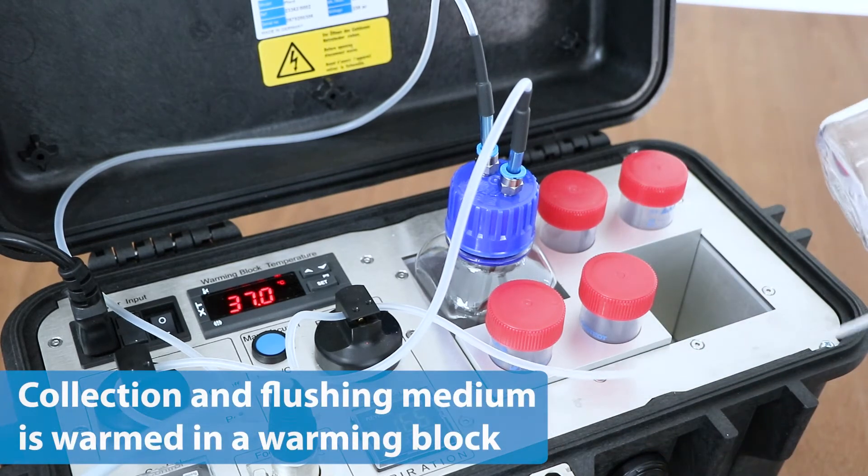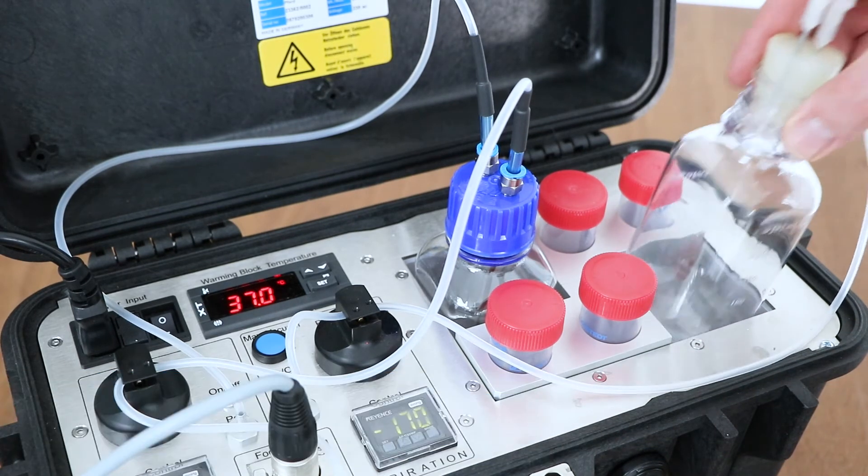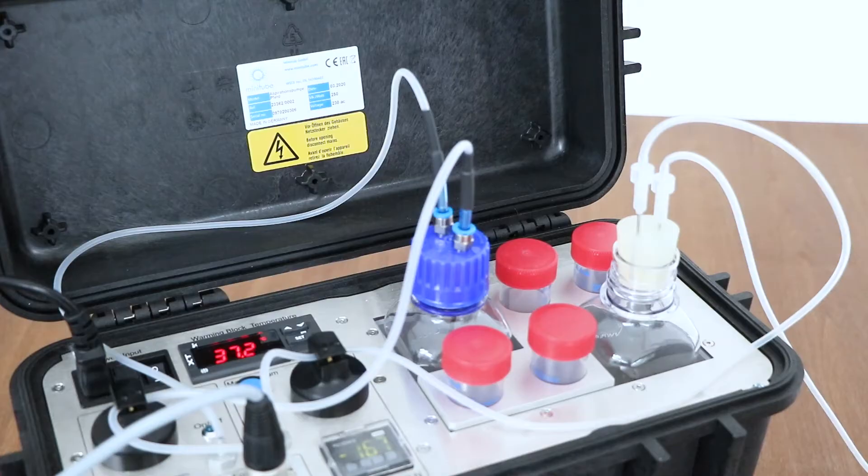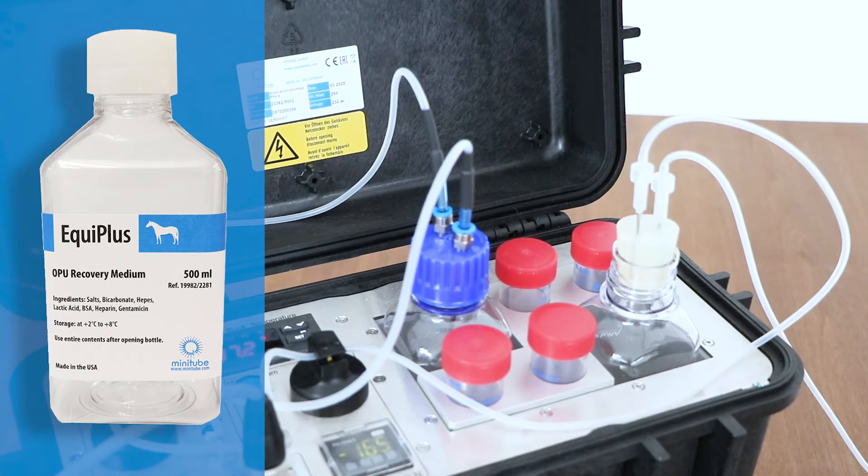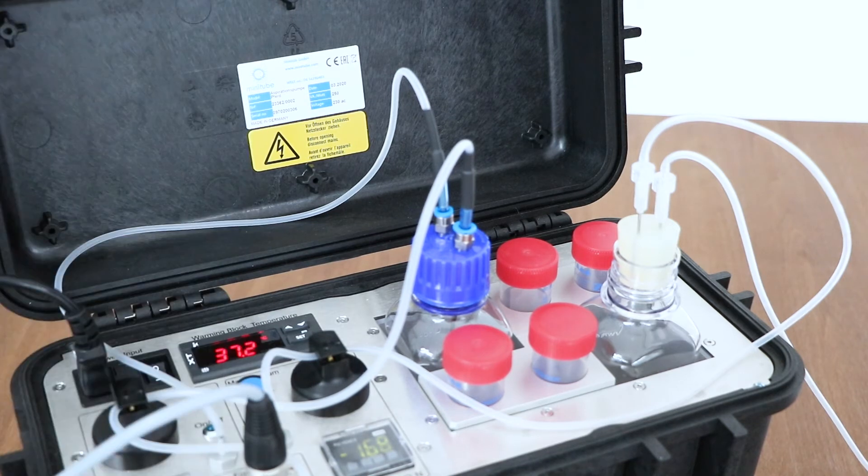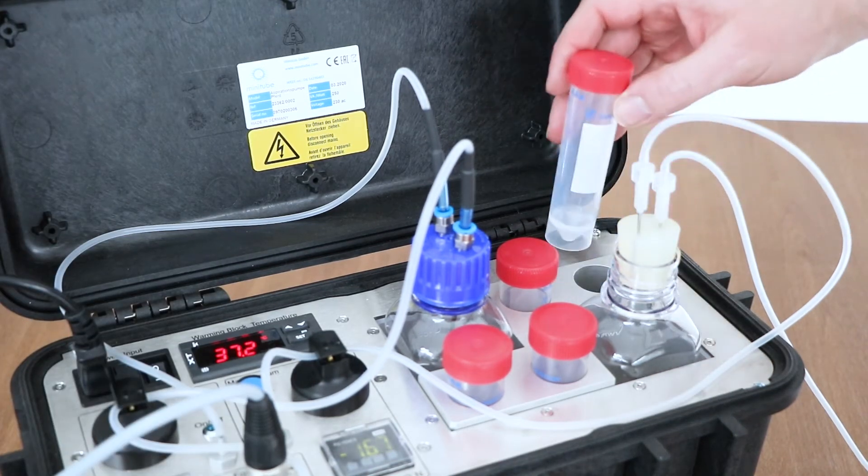The injection and aspiration bottles are enclosed by warm aluminum blocks to provide the correct temperature for the oocytes at all times. The collection and flushing medium is warmed in a warming block containing two 250 milliliter bottles and four additional spaces for 50 milliliter tubes.